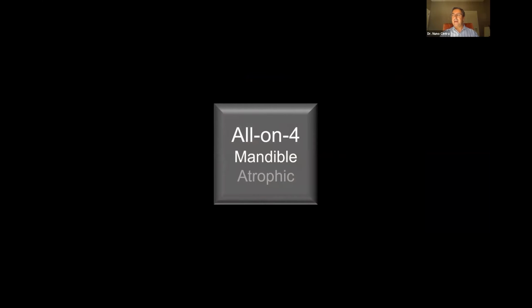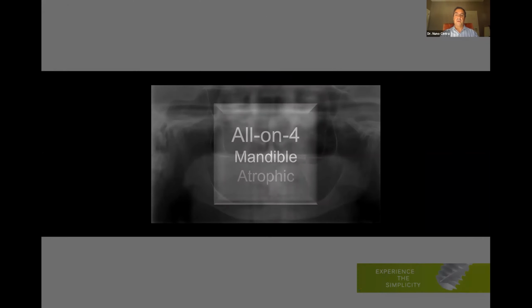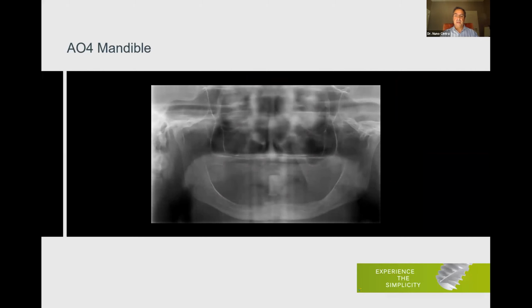What about atrophic mandible? Is there a point to do an all-on-4 for an atrophic mandible? A situation like this. Both foraminas are at the crest. So we cannot start above or behind the nerve. We have to start in front of the nerve. So if we have to start in front of the nerve, why bother to tilt the implant?